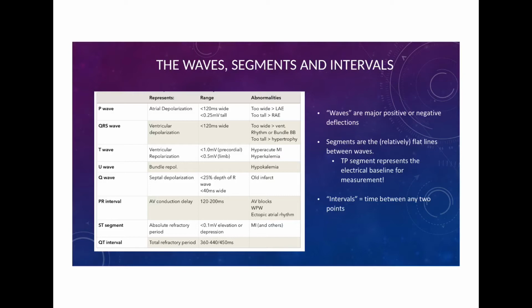And then intervals, these just refer to the time between any 2 points. So that could just be an entire wave. Like you could talk about the QRS interval. That's just the width of the QRS complex. Or you can talk about the QT interval, which is from the start of the QRS complex to the end of the T wave.